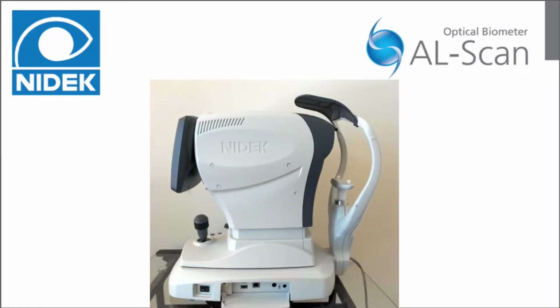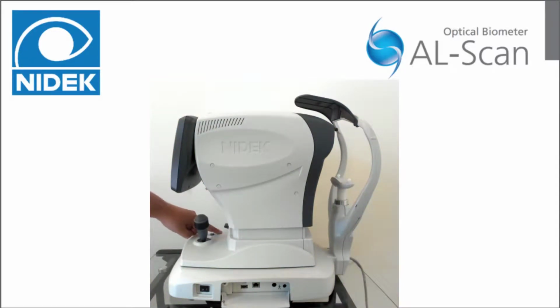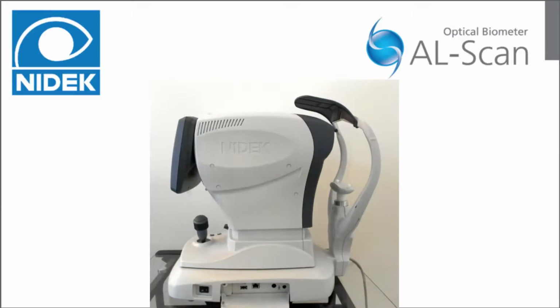On the patient side of the device, we see the patient chin rest, forehead rest, and eye level marker, which is used as a guide for the patient's eye level during measurement. The height of the chin rest should be adjusted so that the centered level of the patient's eye roughly aligns with this marker. The chin rest is adjusted using the up-down buttons that are next to the joystick.